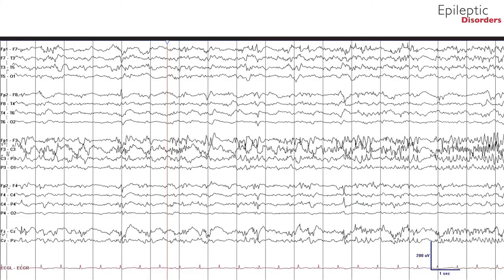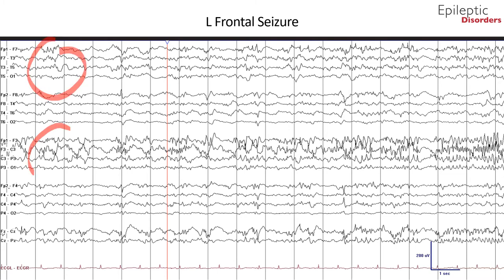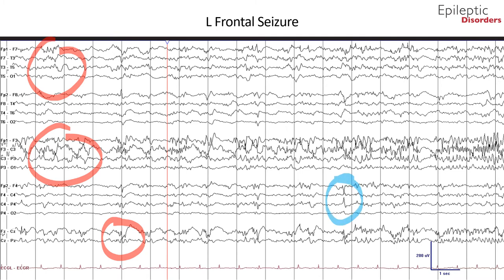We will now talk about a left frontal seizure. In this bipolar montage EEG, there are clear sharp waves and phase reversals over the left frontal region. Additionally, the field is quite broad with spread to the left frontal, midline, and central regions, as well as spread to the right frontal region as highlighted by the blue circle.